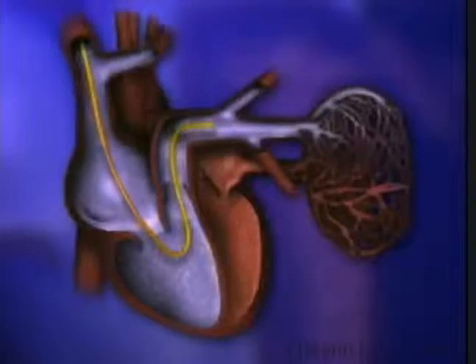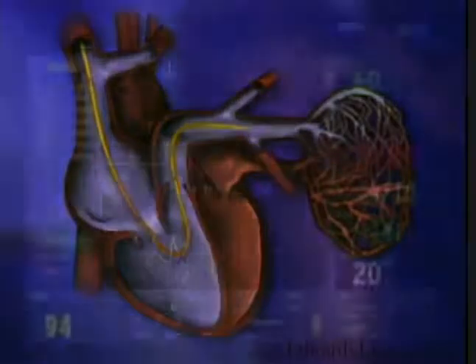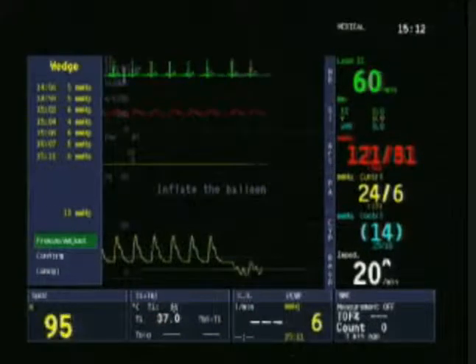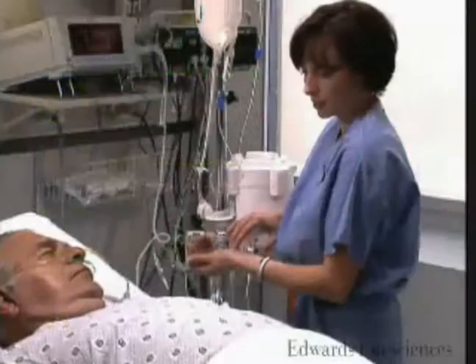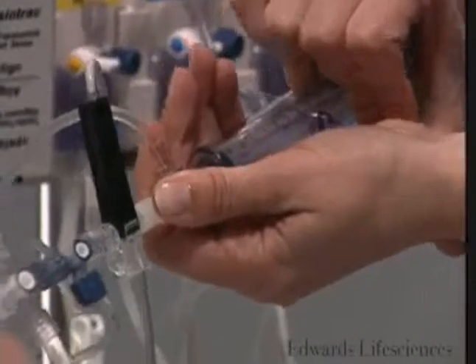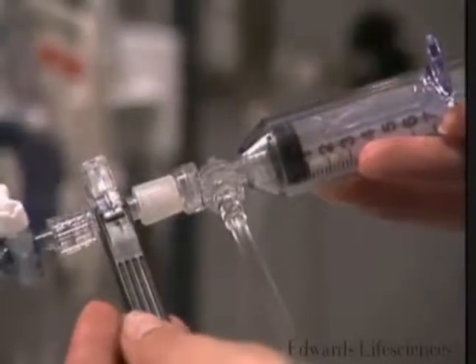Technical considerations to ensure accuracy of cardiac output data include the following: appropriate catheter position. Assure a proper pulmonary artery and wedge waveform from the distal lumen prior to measurement. Appropriate technique. Injection should be smooth and rapid and within 4 seconds. Accurate measurement of temperature of injectate. Use an inline temperature probe.